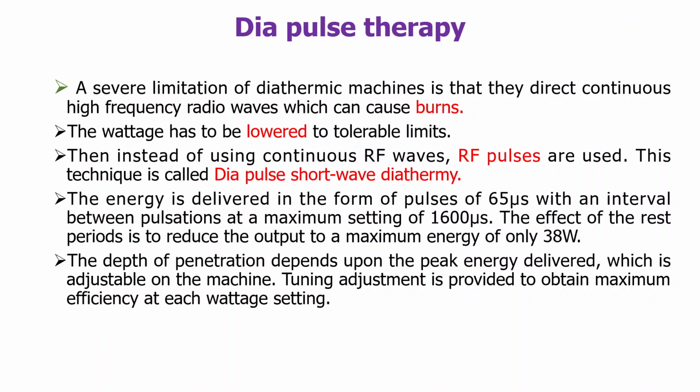So in this video we discussed what diathermy is and what the types of diathermy are. The first method, shortwave diathermy, we discussed. In shortwave diathermy, the waveforms are produced using a transformer and oscillator circuit. We use the LC oscillators here. The waveform generated is a short wave that will be applied to the human body through electrodes. The electrodes are placed around the knee or legs. That will act as the capacitive method, where two plates will be used. In the inductive method, a coil is used. Thank you.